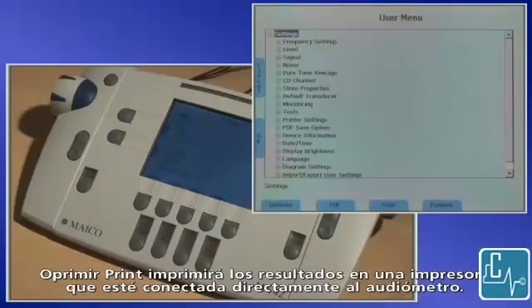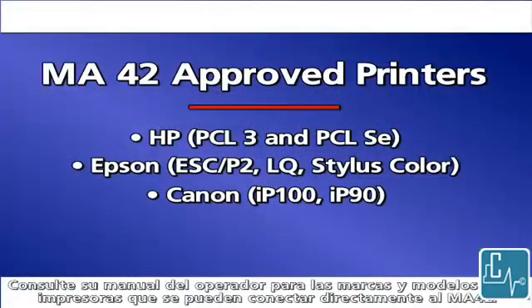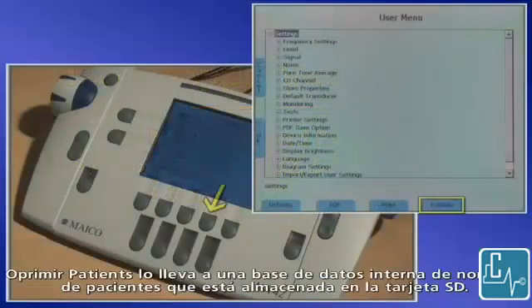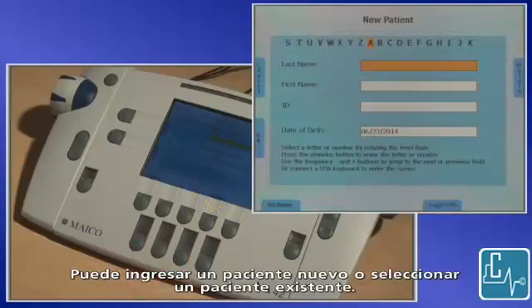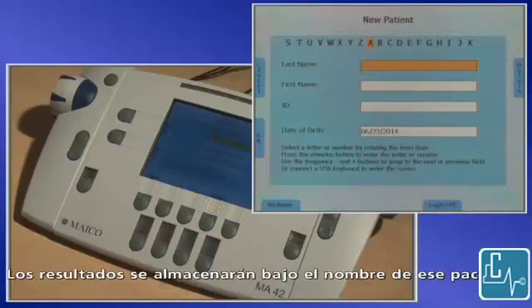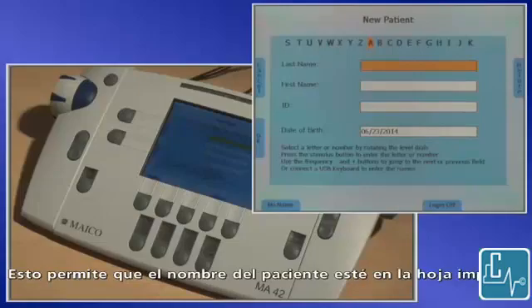Pressing print will print the results to a printer that is connected directly to the audiometer. There are several printers approved for this purpose. Please refer to your operator's manual for the make and model of printers that may connect directly to the MA42. Pressing patients takes you to an internal database of patient names that is stored on the SD card. Enter your PIN to access the database. You can enter a new patient or select an existing patient. The results will be stored under this patient's name. In order to print the result, you must also then select print or PDF. This will allow the patient name to be on the printout.